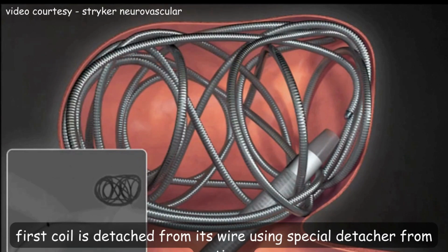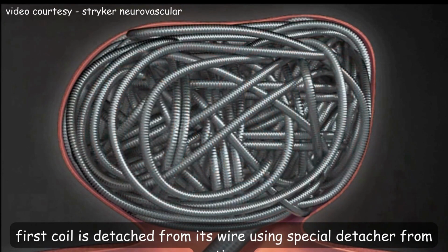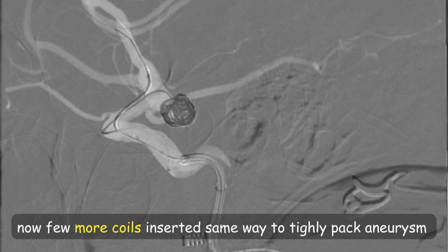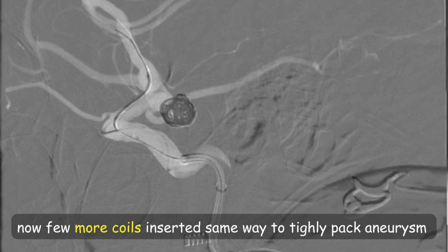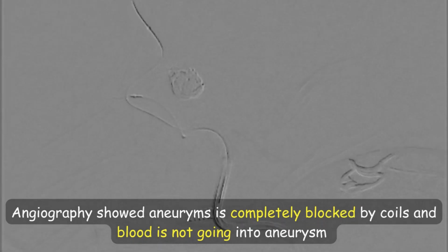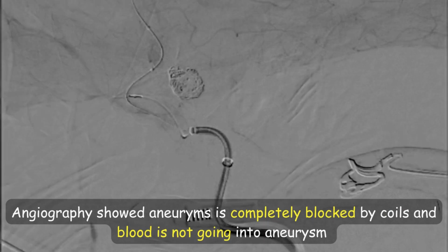The tube is still inside the aneurysm. Now we'll take a second coil through the same tube and tightly pack the aneurysm. A few more coils are inserted the same way to tightly pack the aneurysm under X-ray guidance. Angiography was done which showed the aneurysm is completely blocked by coils and no blood is going inside the aneurysm.